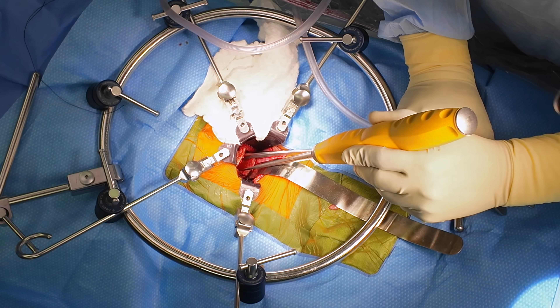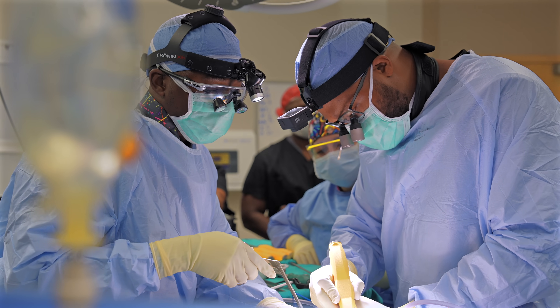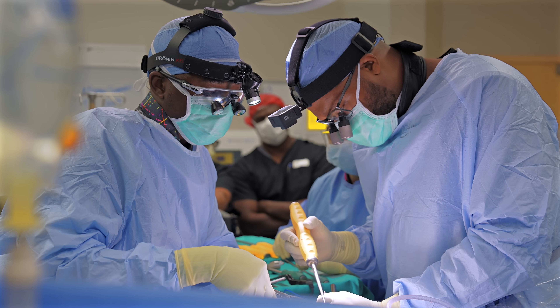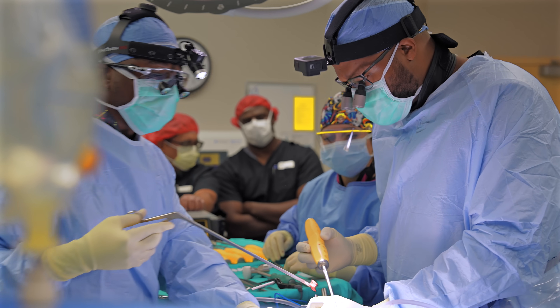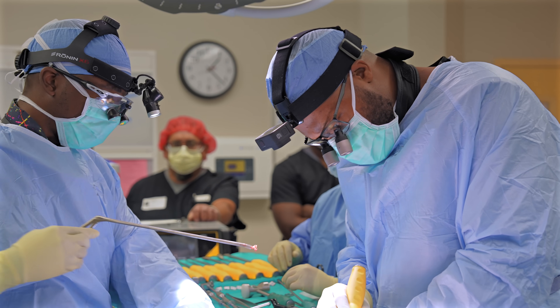We're getting close, carefully operating right on top of her spinal canal here. Oh, there's the disc right there. Oh wow, look at that. So we just pulled that out from right on top of her nerves there.